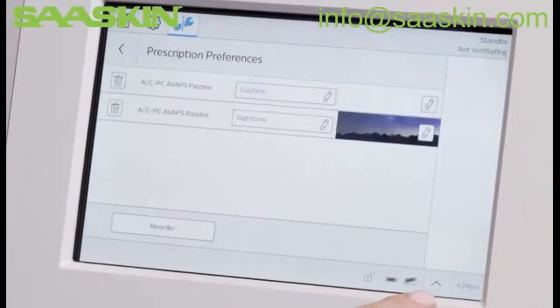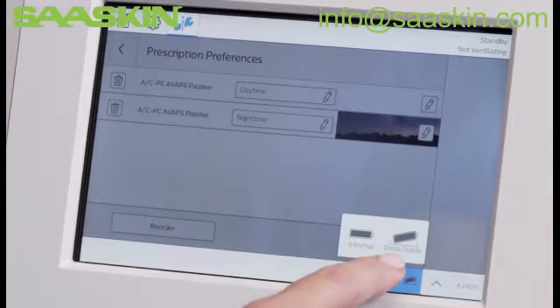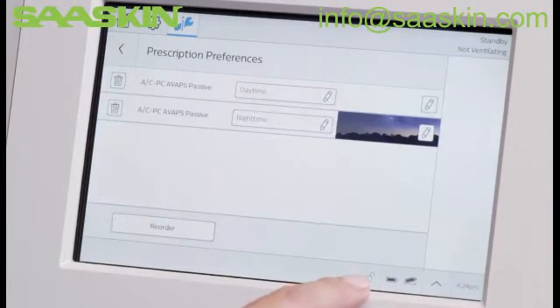You can check the status of the batteries by pressing the battery icon. Note that while ventilating, the device displays an estimate of the time remaining in each battery. Since we are still in full access mode, the unlock icon is displayed.